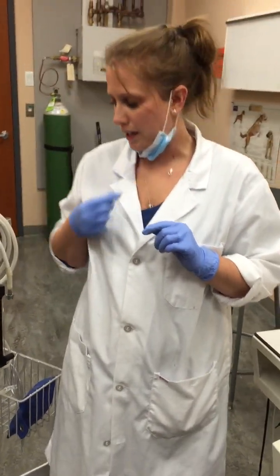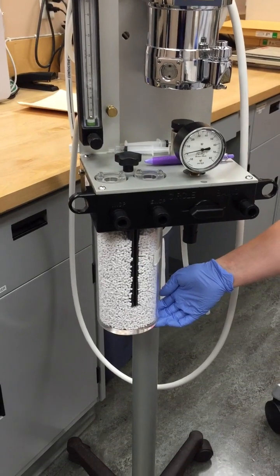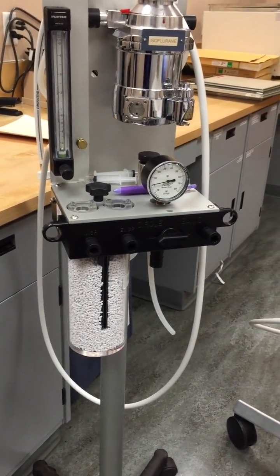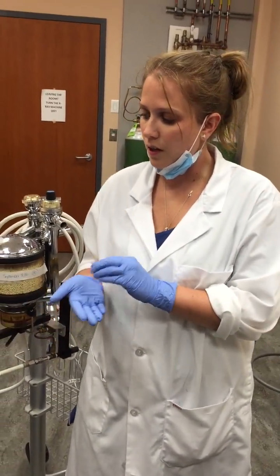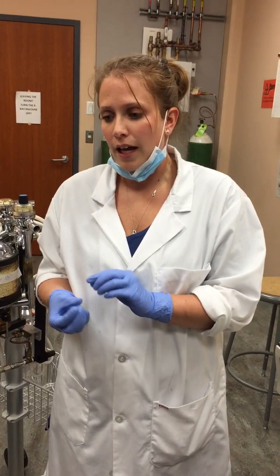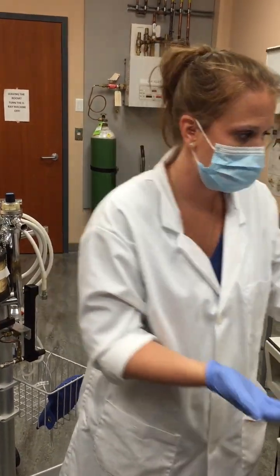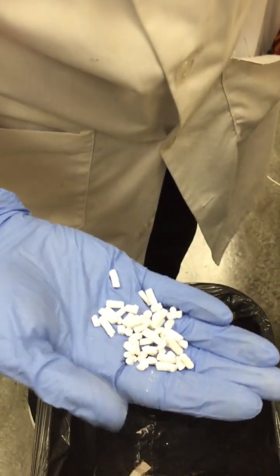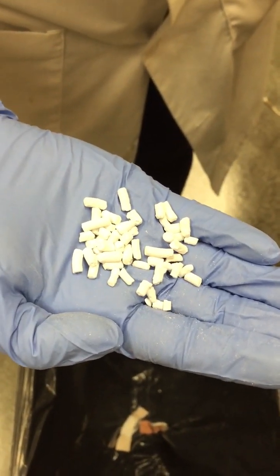If you're changing a CO2 canister that already has granules in it, such as this canister here, and I'll demonstrate how to safely take that off in a minute, what you need to do is make sure that you observe and check the granules. So with your gloves on, evaluate the granules to see how exhausted they are. Exhausted granules will look very dry and they'll feel brittle and they won't have a lot of that excess dust that the new ones have. These ones have that extra dust that will fall off of them. The exhausted granules will not have that, and they will look much drier and much more brittle.